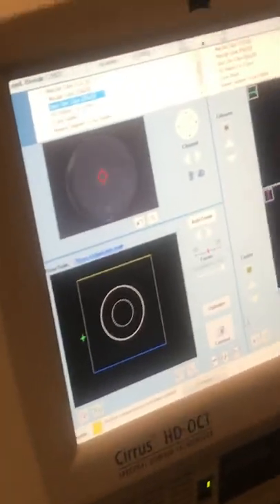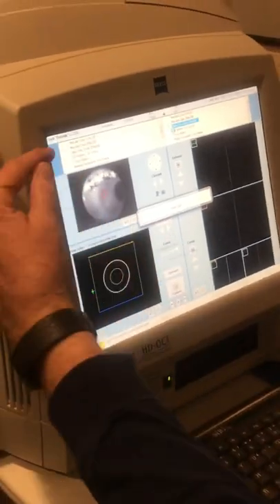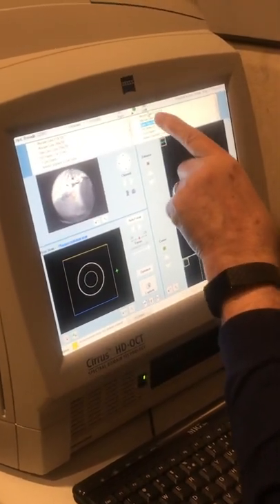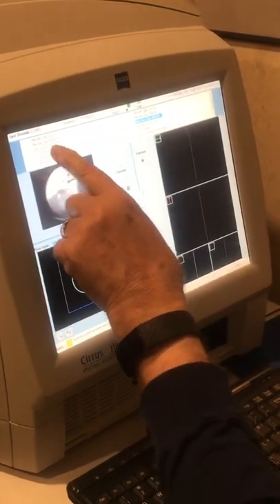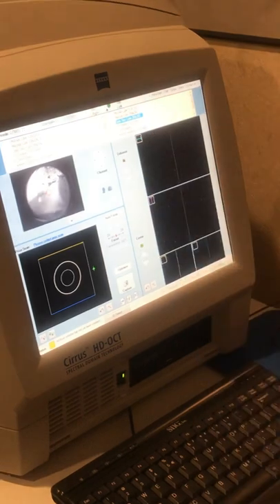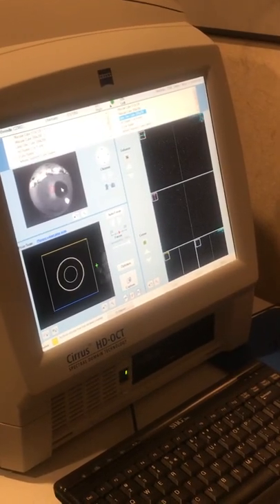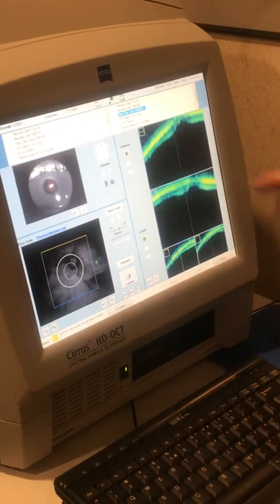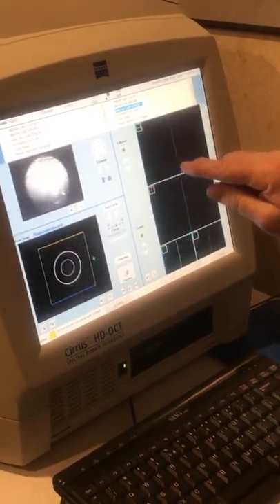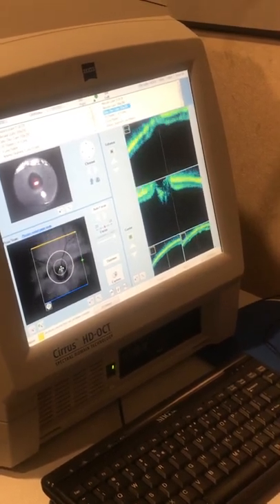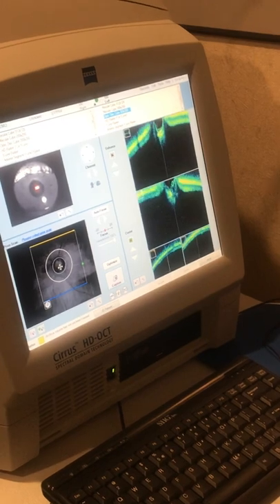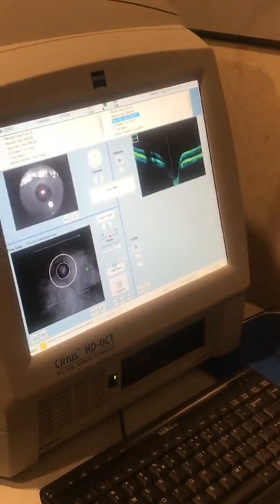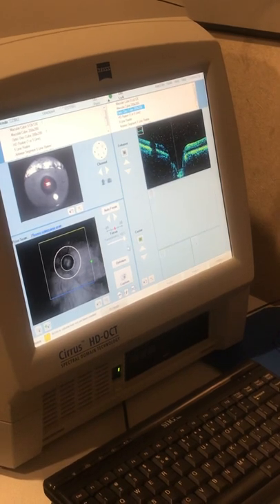Put your chin on the left side, please. We left off with the optic disc cubed, and when we came to the left side the machine told us we're on the left eye — we choose from the menu. Because we left off with the optic disc cubed, it defaulted to that. Her target's off to her right — look at the very center of that little star. The image is actually upside down; the optic disc usually has a valley to look into. Let's optimize again — the machine should find the optimal spot, and it did really well.